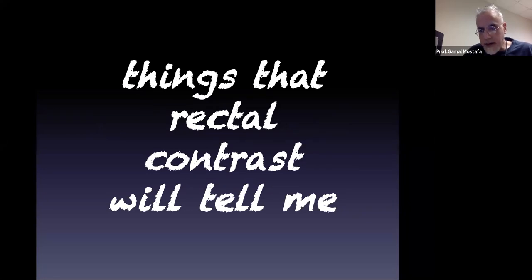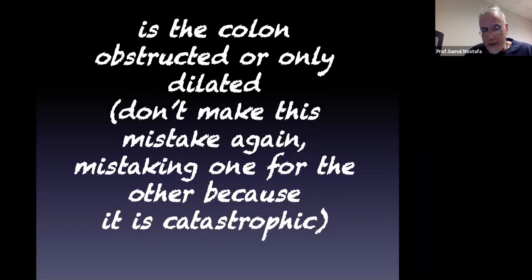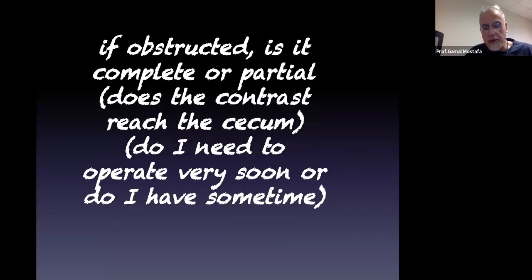Things about the rectal contrast can tell you, I think we're redundant now. We talked about all this. Is the colon obstructed or dilated? Don't make the mistake again of taking somebody with dilated colon to the OR because she or he doesn't need to be there. If obstruction, is it complete or partial?